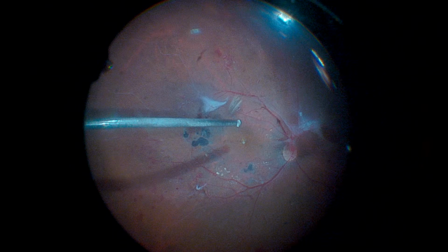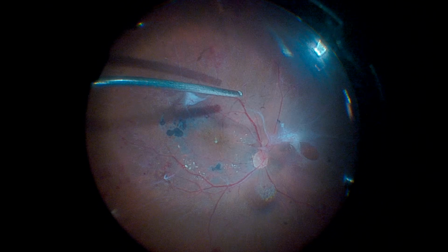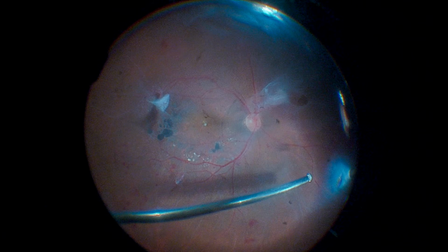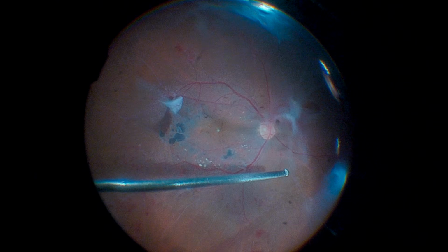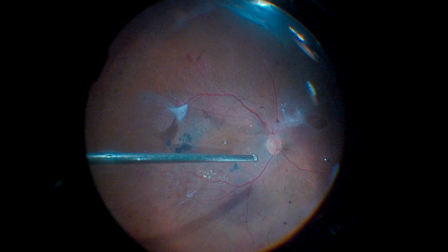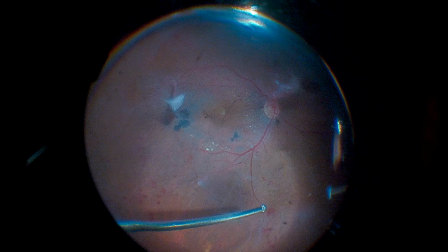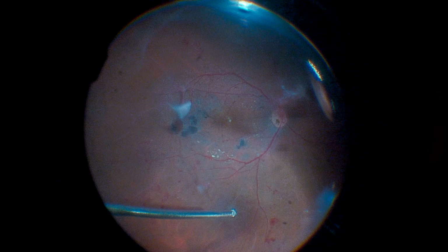near the optic disc. We can observe areas of fibrovascular proliferation connected to the optic nerve, with a vascularized pedicle in the inferior temporal arcade. Initially, the surgeon performs a core vitrectomy, isolating the traction areas from the posterior pole to the peripheral retina.